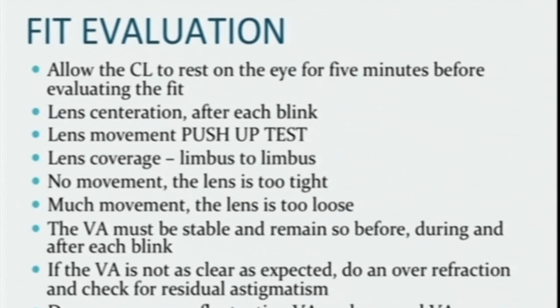How do you evaluate the fit? Allow the contact lens to rest on the eye for 5 minutes before evaluating the fit. Lens centration after each blink should be evaluated, and you can check the visual acuity after the contact lens has been placed on for 5 minutes. If there is no movement, then the lens is too tight. If there is excessive movement, it's too loose. And the visual acuity should be stable whether before or after the blink.